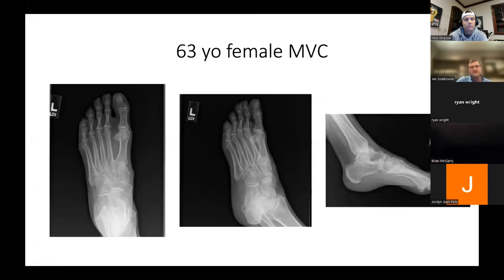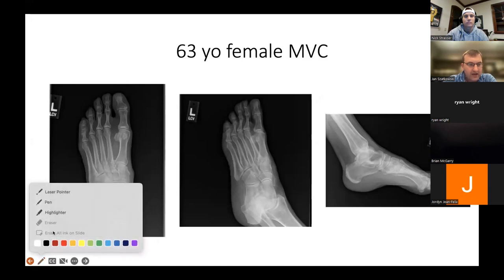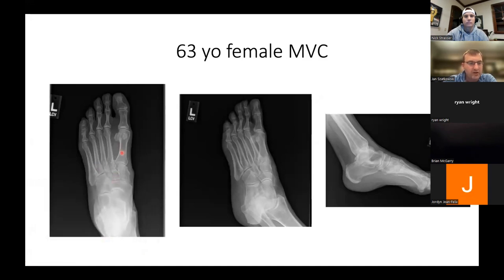Here's a case: 63-year-old female involved in a motor vehicle accident with midfoot pain. These are a couple of the x-ray views. The far left is the AP view — we're looking straight at the foot. Here's the oblique view — you can see the foot is turned, or at least the x-ray images are. And on the right we have the lateral image. Nick, when you're looking at the AP, how are you assessing the Lisfranc here?